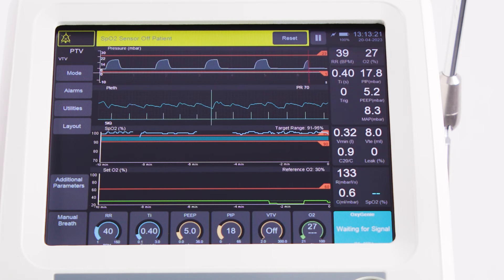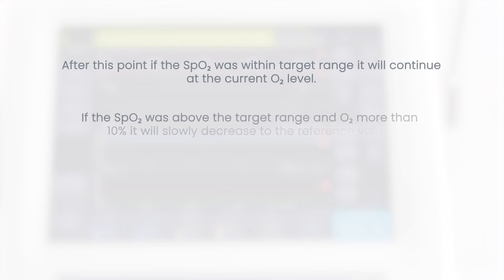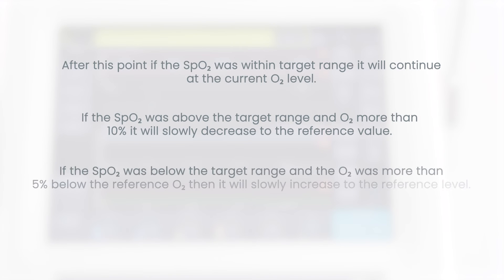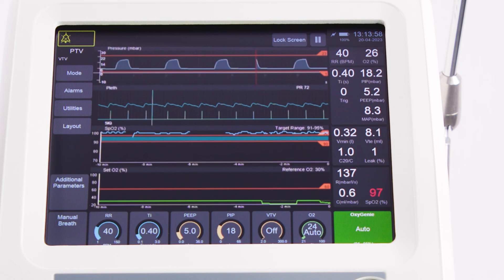The user will be advised on screen if the SpO2 signal is lost. Oxygeni will display in blue 'waiting for signal' and remain at the current O2 value for the first 60 seconds. After this point, if the SpO2 was within target range, it will continue at the current O2 level. If the SpO2 was above the target range and O2 more than 10%, it will slowly decrease to the reference value. If the SpO2 was below the target range and the O2 was more than 5% below the reference O2, it will slowly increase to the reference level. Once a valid SpO2 signal is restored, Oxygeni will return to adjusting the O2 to keep the SpO2 in the target range.